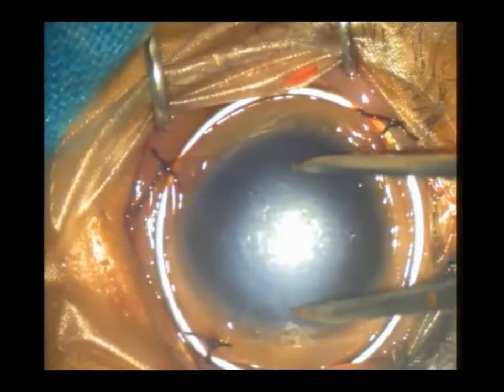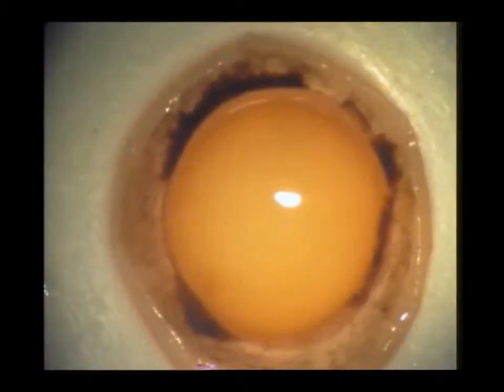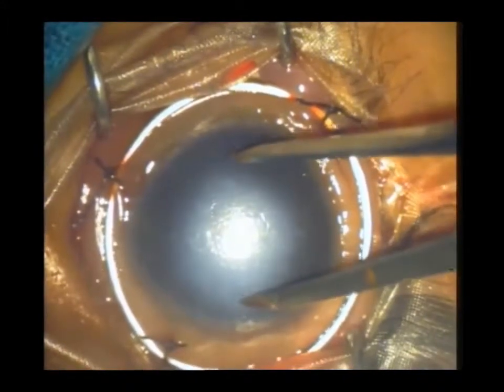The size of the corneal button is measured with the help of a caliper. The donor button is then trephined with the help of a 7 mm disposable trephine.